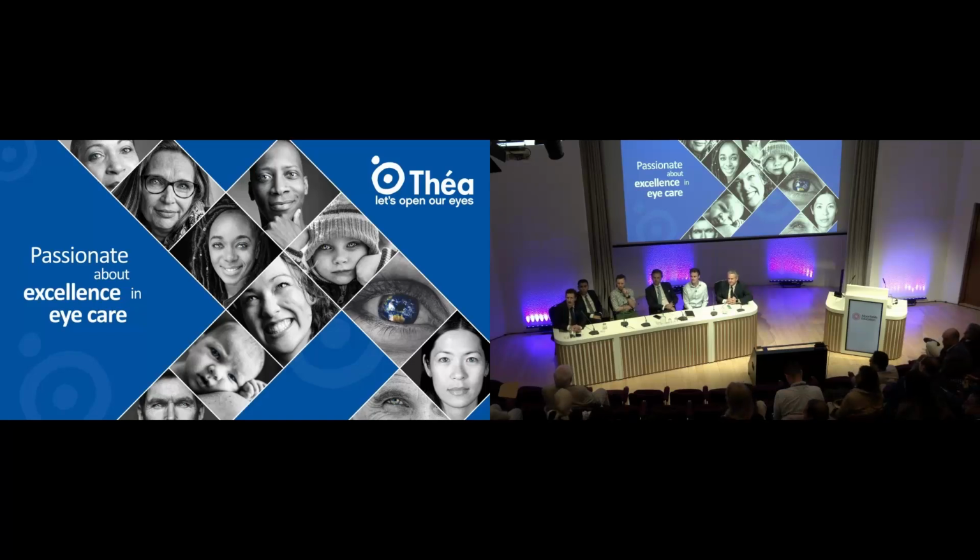Question there. May I ask the panel, there are so many different types of refractive laser now: PRK, LASIK, and SMILE. Most of the patients will need cataract surgery in the future. Would that make biometric measurements more difficult in the future? And the second question is, when the patients opt to have an EDOF lens or multifocal lenses after this kind of laser, is there any other consideration we have to make?